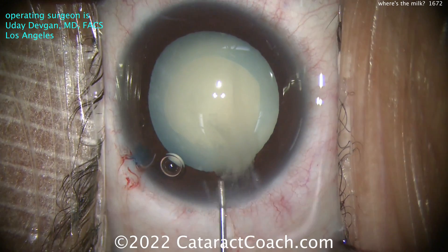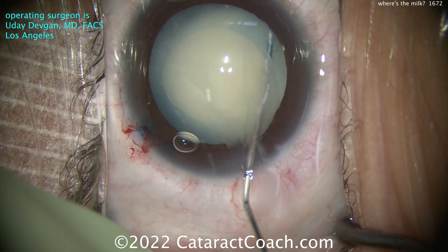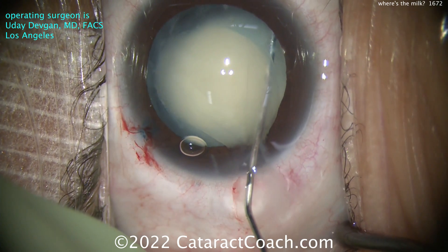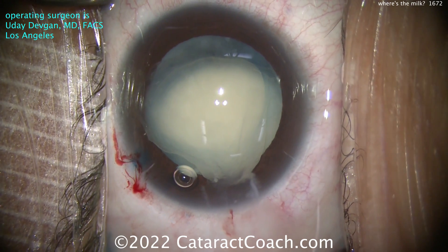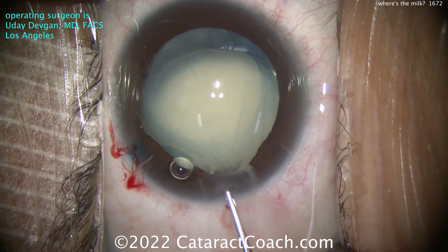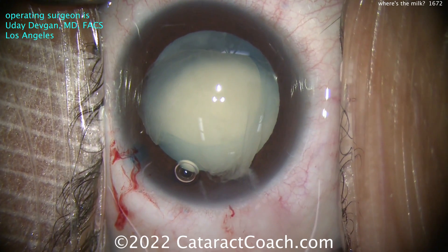We're showing the whole video start to finish - I think there's a lot of benefit for a younger surgeon especially to see a complete cataract case. Now this step: careful, minimal hydrodissection - minimal. A little bit of cortex is coming out and it looks almost gel-shaped instead of purely liquid. A little more viscoelastic here to protect that central endothelium.